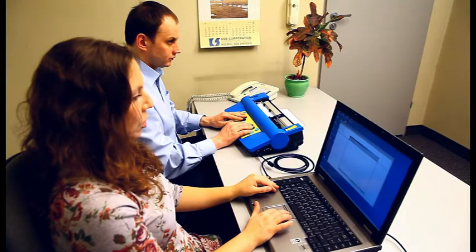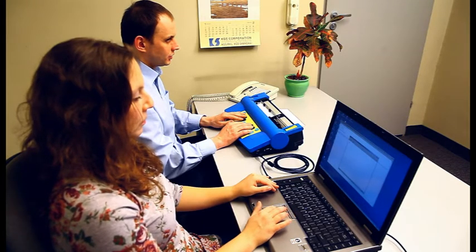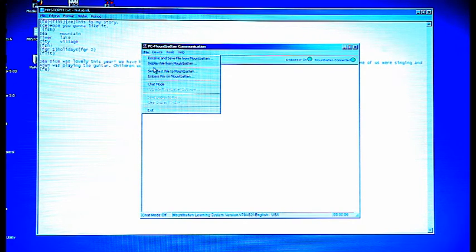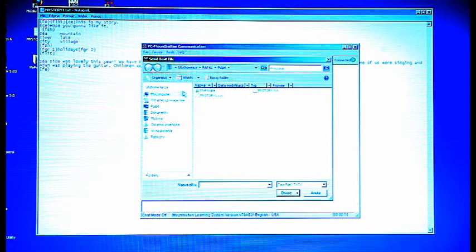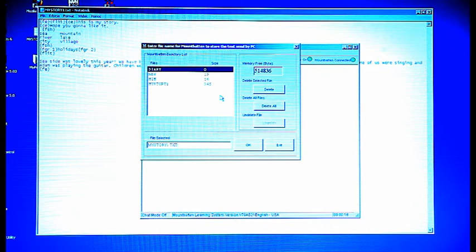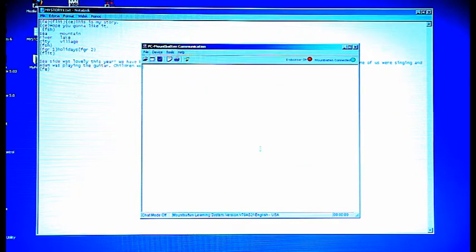When you have created a file on your PC, you may want to emboss it and at the same time save it in the Mountbatten's memory. In the File menu, select Send Text File to Mountbatten. When the dialog box appears, pick the file you want to send and press Open. Another dialog box will appear showing the content of your Mountbatten. At the bottom of this dialog box, you will see the name of the file you are sending. We recommend you remove the extension TXT from the name.